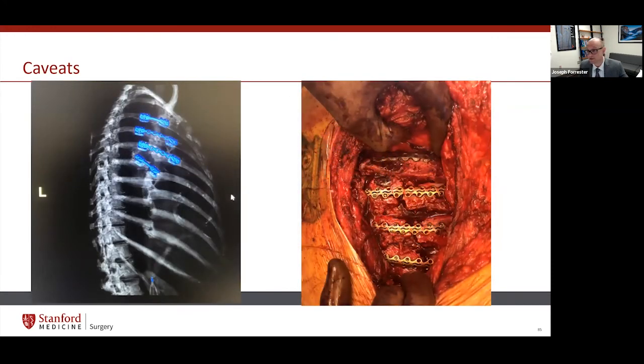As I mentioned, when these surgeries go wrong, it can create a lot of work. Here's a CT reformat from a 46-year-old polytrauma patient who was sent to me from another hospital in the Bay Area about 4 months after her trauma. In the CT reformat on the left, you can see she has experienced plate failure and malunion. Her lowest plate is bent downwards and her entire chest wall has shifted down a rib space. She was crippled with pain, requiring a wheelchair for movement.